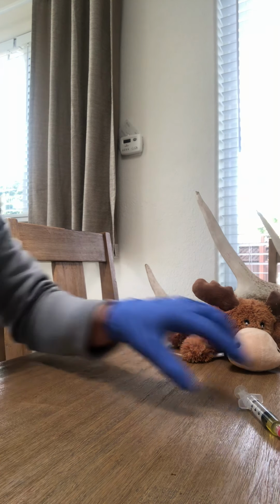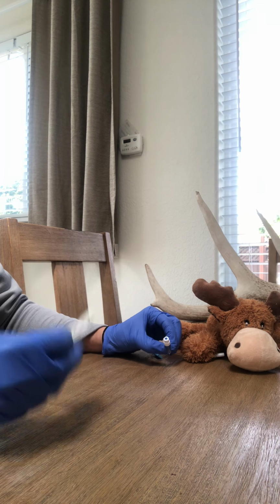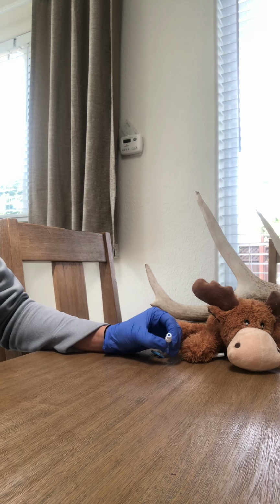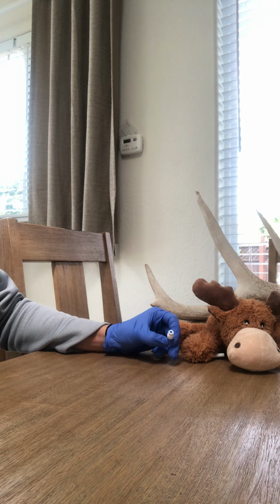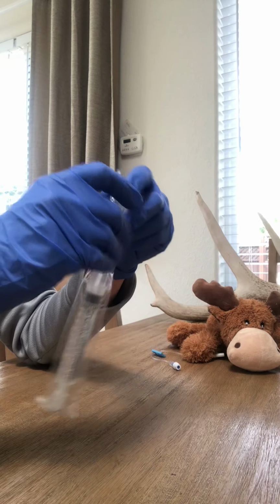My patient. Okay. So the first thing I'm going to do is take their IV port with an alcohol swab. I'm going to cleanse it, allow it to dry. I'm going to have to cleanse it again because I forgot to open this.